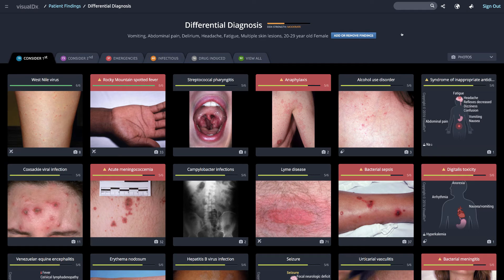Another icon you might see is a radiation symbol, which indicates a diagnosis resulting from chemical, biologic, radiation, or nuclear exposure. The camera shows how many disease photos, symptom-cons, and other images we have in our database for that disease.